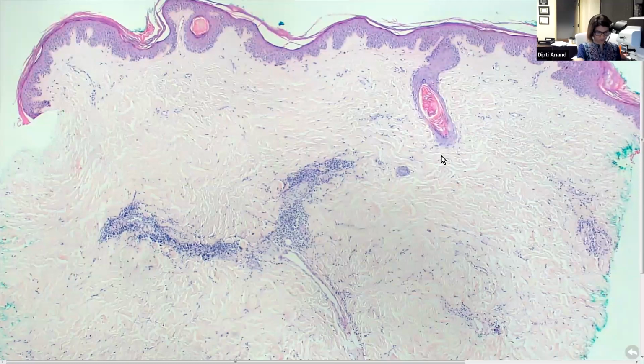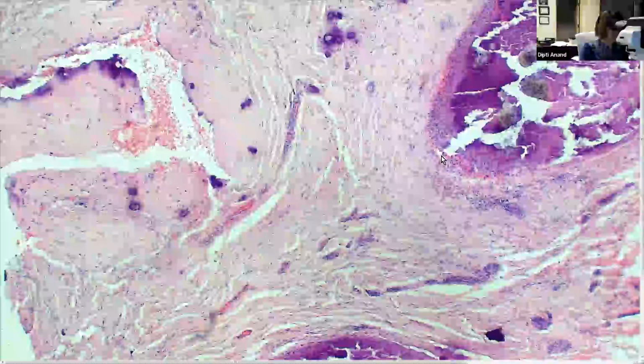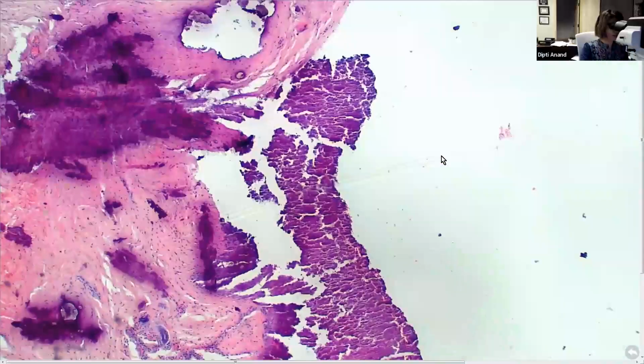If you get a thick dermis with an involvement of the epidermis, which kind of looks like interface, that's what you would see in chronic sclerodermoid GVHD. But otherwise, you shouldn't get any epidermal involvement in morphea. Okay. You have your slide number 8. So again, we are going to talk about this in the next class, so it's nice to get a little introduction to it.